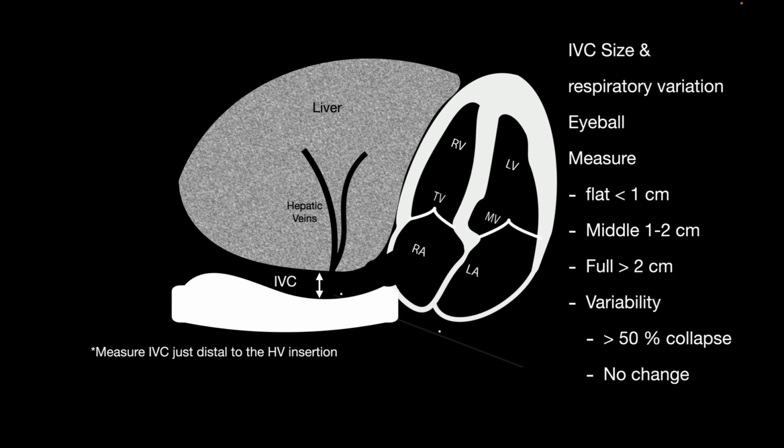And generally speaking, you can get 2 good windows in most patients, and in some patients you can get all 3 windows really nicely. So keep looking and keep trying, because you will get there eventually.